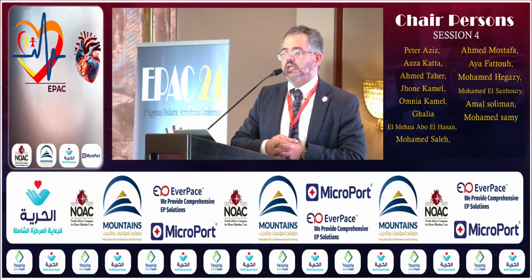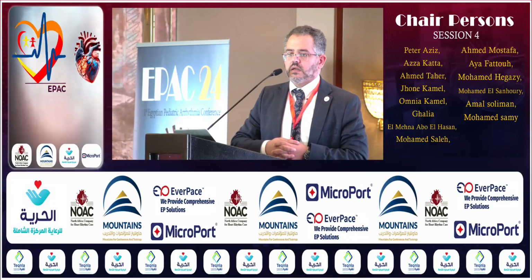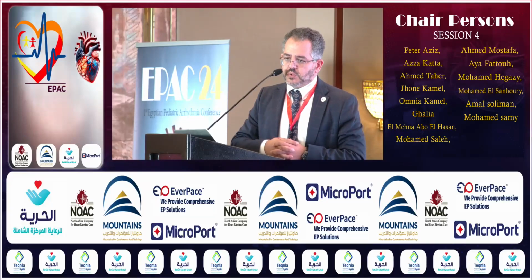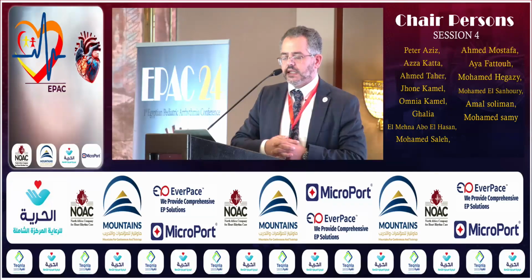The only concern some of us have with cryoablation is potentially that the risk of recurrence might be slightly higher. Now this is debatable. The more recent evidence does not support this conclusion, but in the early stages with cryo, you had slightly higher recurrence than with radiofrequency.